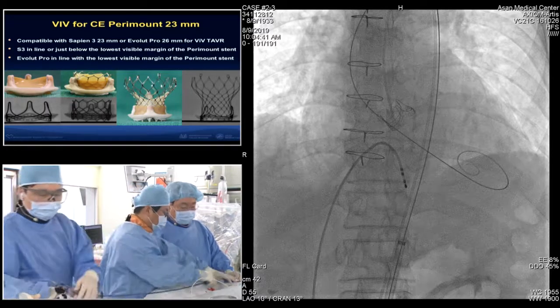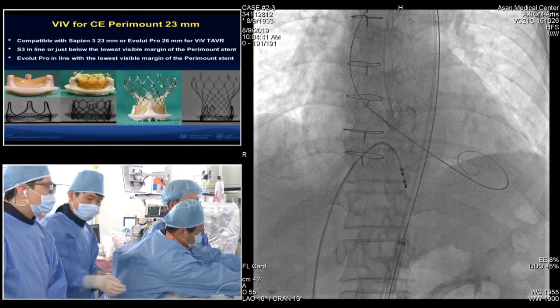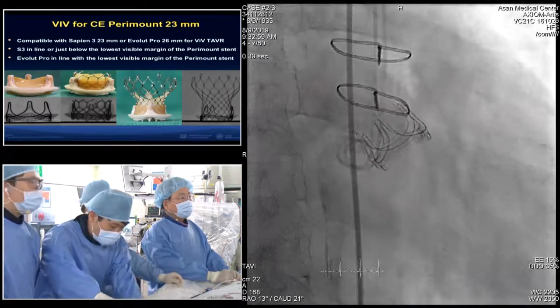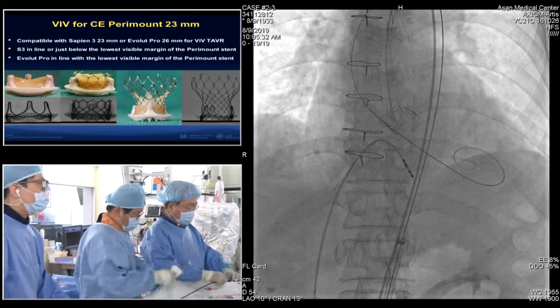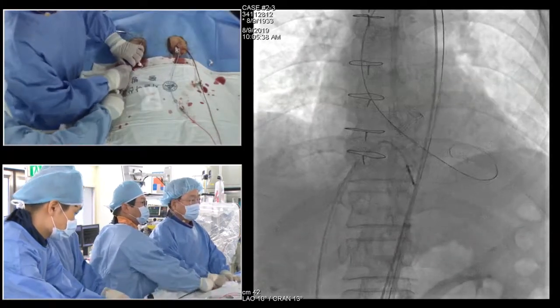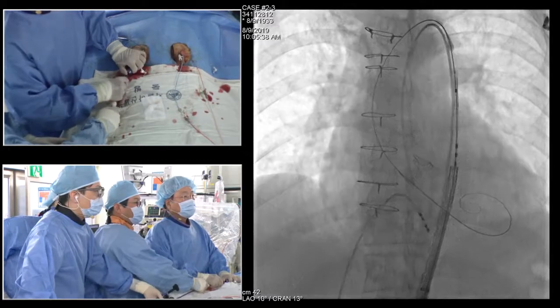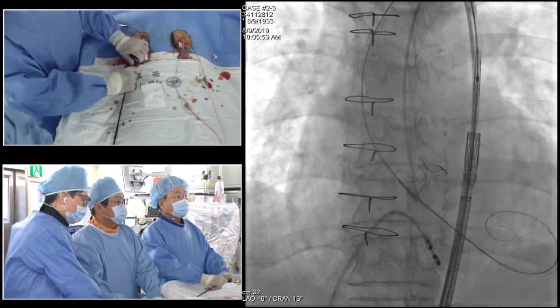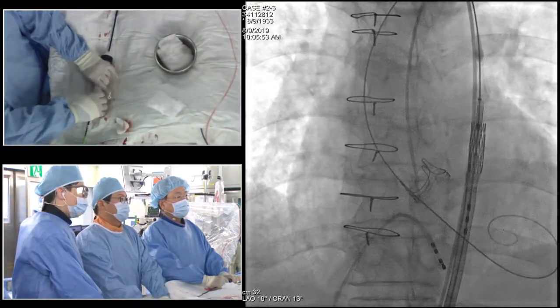Your turn. I don't want to be destructive, and I understand the technique. I understand the necessity to not leave a patient with a gradient. But I never quite understood why, when you have a degenerated bioprosthetic valve and you do a valve-in-valve, you would be doing a cracking before you know exactly what the valve-in-valve implant hemodynamic is. In most cases you do know beforehand if you have a good gradient, or something you need to correct.